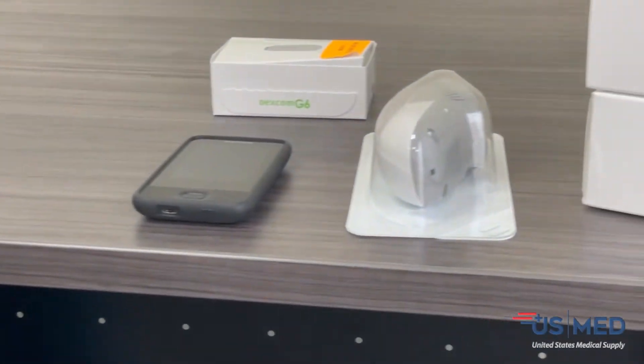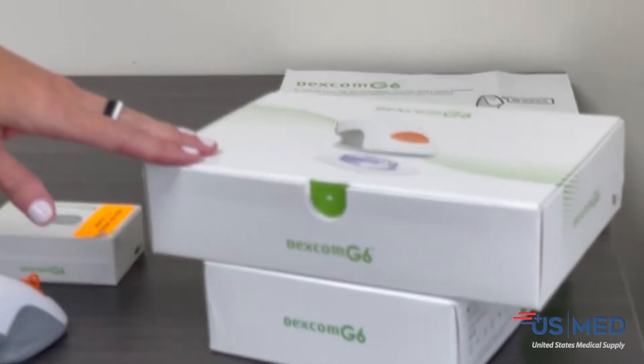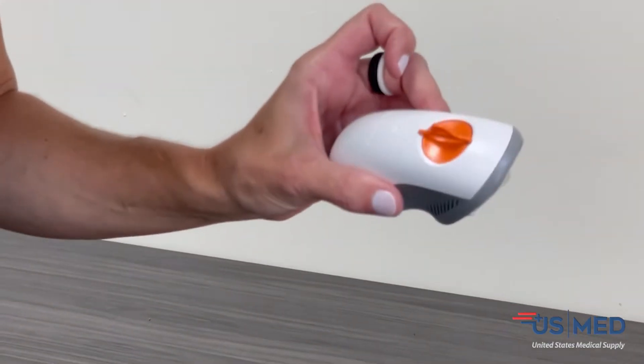When you first receive your Dexcom supplies, we send a 90-day supply. You will have three boxes of sensors. Each box is going to have three sensor applicators for a total of nine sensors.